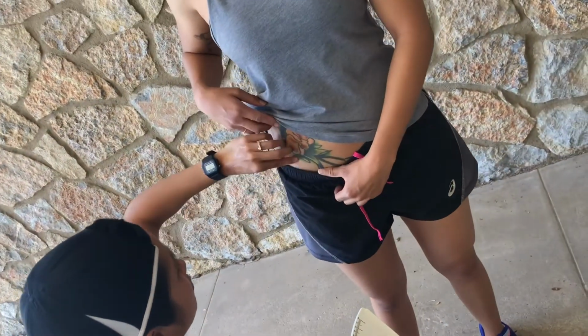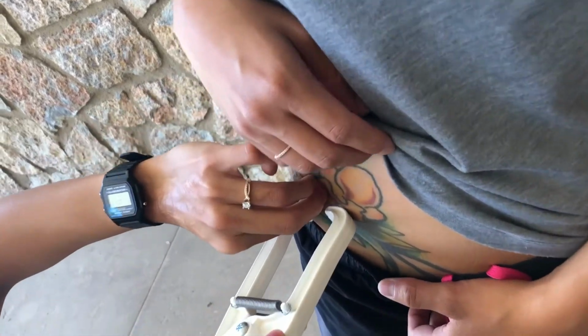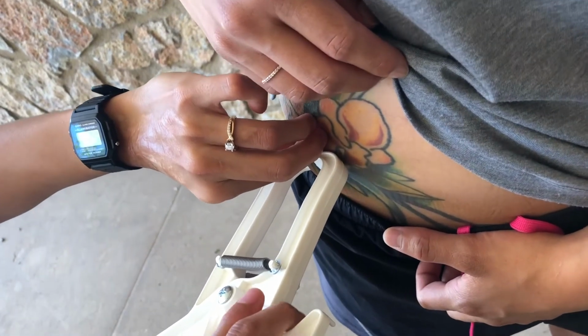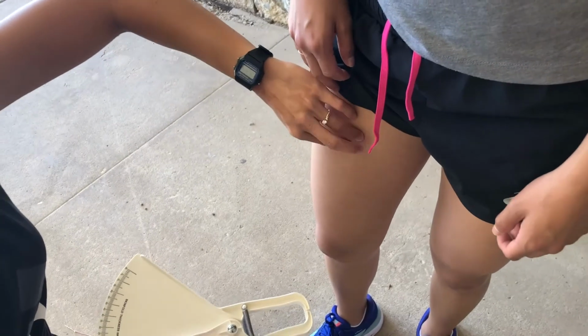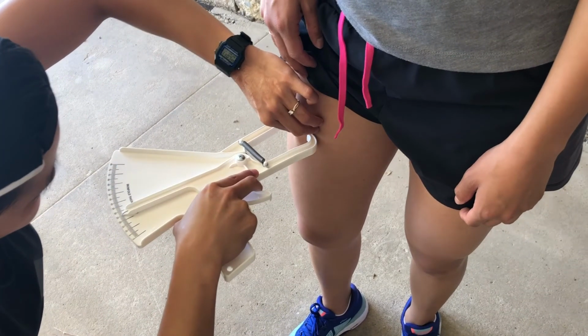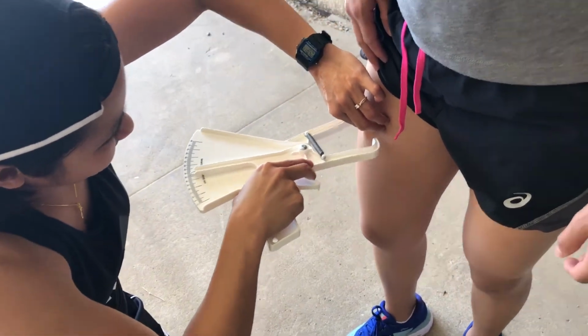The sixth site is the suprailiac site, which calls for a diagonal fold in line with the natural angle of the iliac crest. The last site for this test is the thigh. This calls for a vertical fold on the anterior midline of the thigh, midway between the proximal border of the patella and the inguinal crease, the hip.